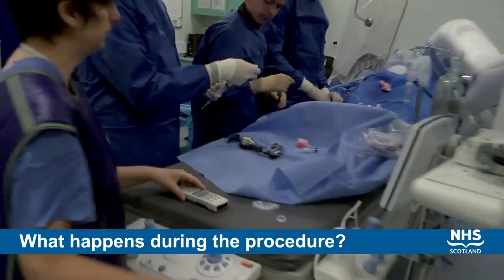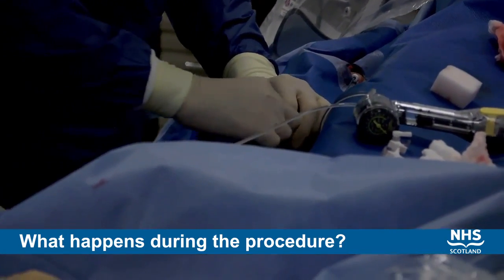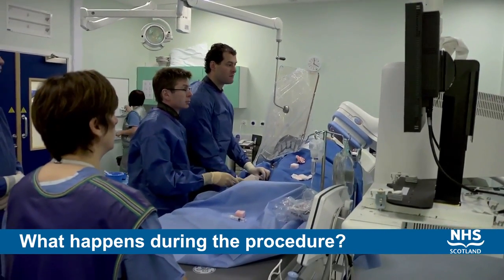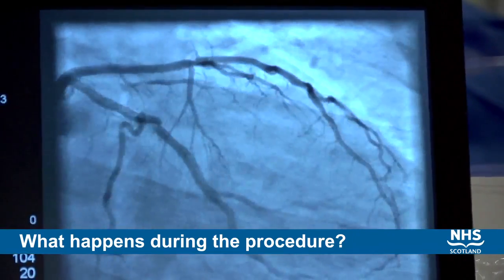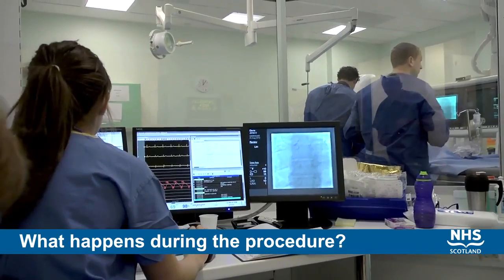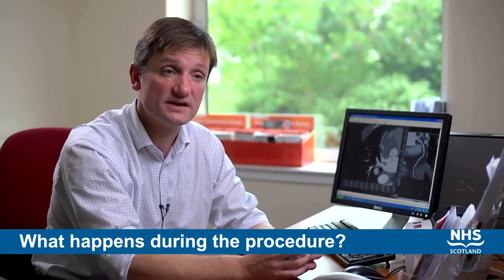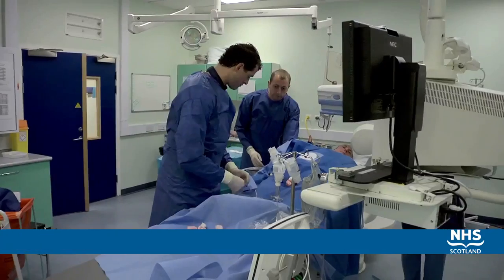This may involve passing a very fine guide wire across the coronary artery narrowing and administering a test drug called adenosine, which will result in a degree of flushing or chest tightness, which is very short-lived and only lasts a few minutes. And this test allows us to further assess the severity of coronary narrowings and whether they need treatment.